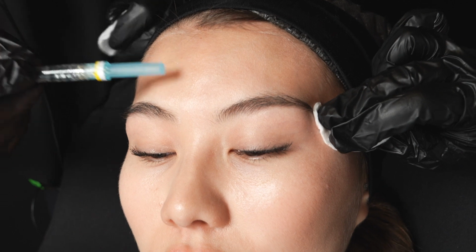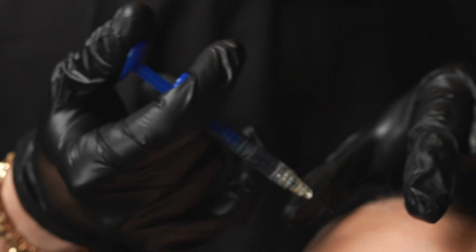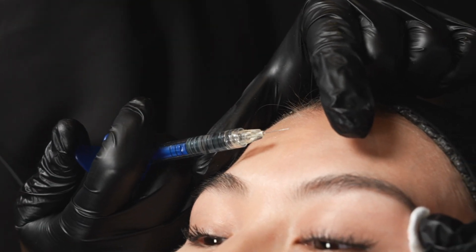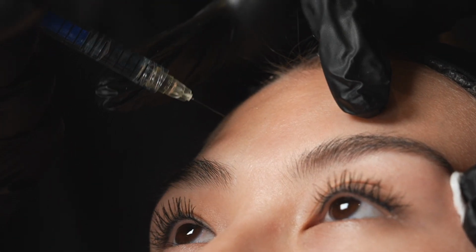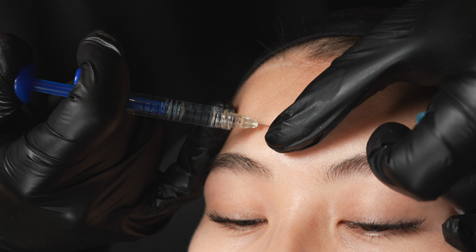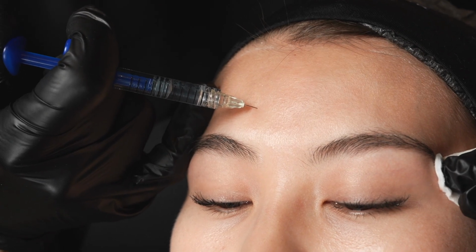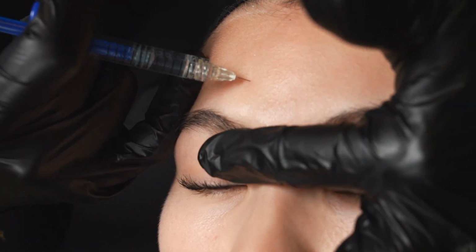Помните, да? Ну вот видите, тут немножко меньше объема, чем надо. Я хочу туда ввести инъекцию. Опять-таки я проверяю иглу. Ну вот здесь они выходят на поверхность, да, и далее. Если я работаю на надкостнице, достиг надкостницы и потом меняю угол, я знаю, что я под гале. Я знаю это.